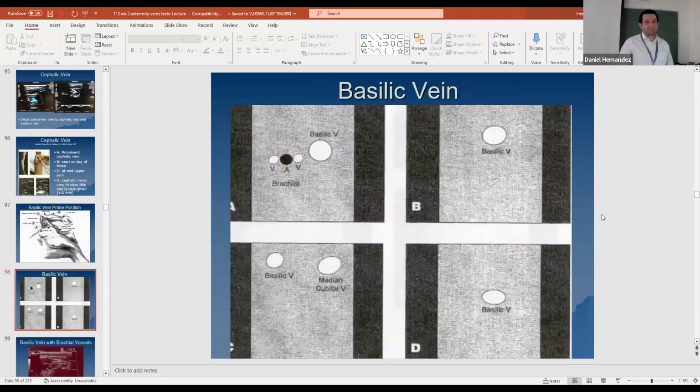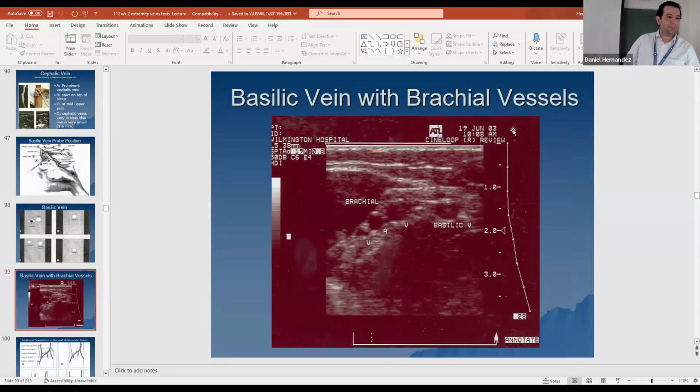And then basilic vein. Again, we can visualize the basilic vein in the upper arm. We can see it there in proximity to the brachials. We follow that basilic vein down the medial portion of the upper arm. So when we're imaging and that patient's arm is out, up here on that inner arm is the brachials. I come down a little bit into that upper arm, and that's where usually the basilic vein resides, and we can follow it down that inner portion of the upper arm and down the medial aspect of that forearm. Then it goes all the way down the arm towards the wrist.